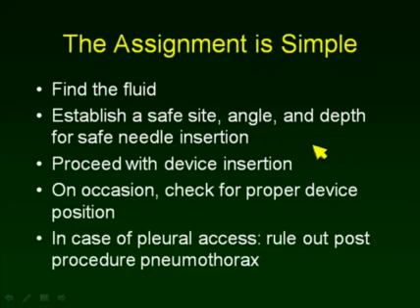The assignment, therefore, is simple. Find the fluid, establish a safe site, angle, and depth for needle insertion, then proceed with device insertion, and on occasion, if it's a large device, check for proper device position. And for those who are interested in safety, of course, any thoracentesis would be followed by a post-procedure check for pneumothorax, checking for sliding lung.